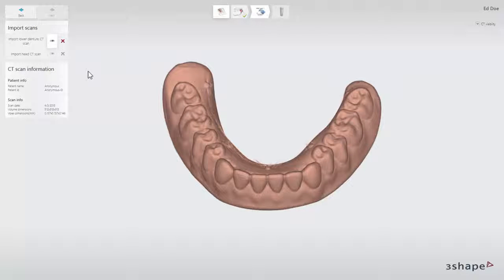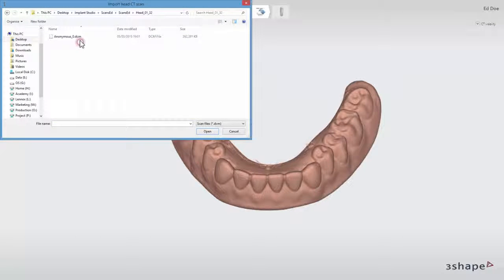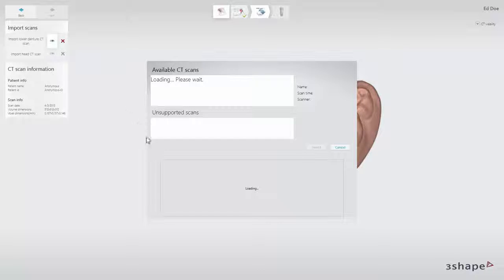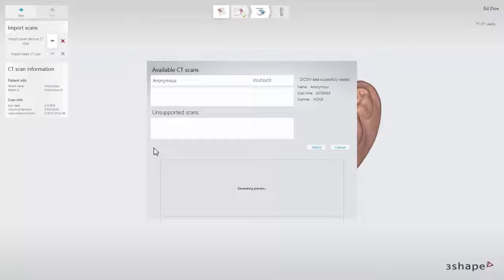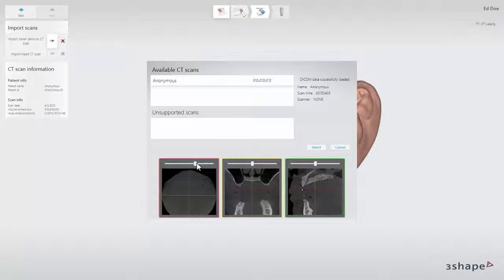To import the head CT scan, click the Import Head CT Scan button. Browse to find the correct file. Preview the scan and click Select to load the scan.